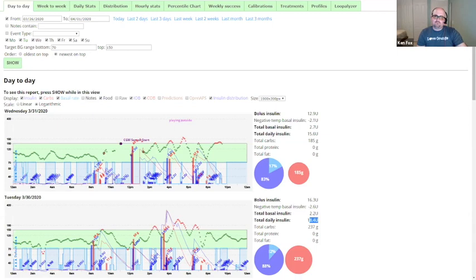It's taken more than 6 months, and I think our endo might finally get the fact that basal and bolus ratios don't matter because it's how Loop gave the insulin. So hopefully that helps. Anybody else have some fun questions before we wrap up? I think you stunned him, Kenny. Sorry, that was a lot at once.